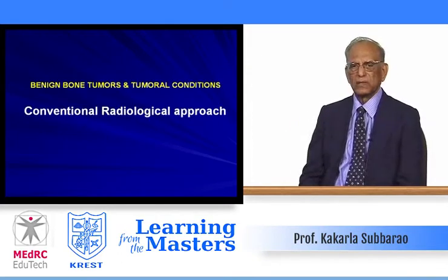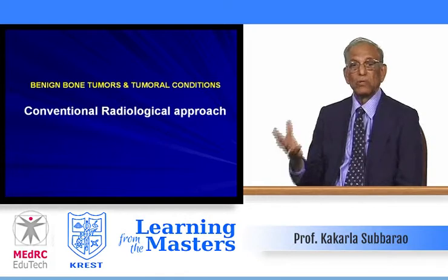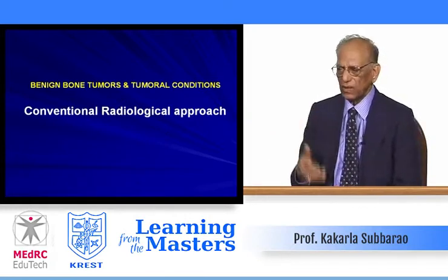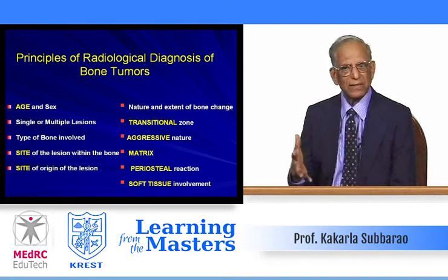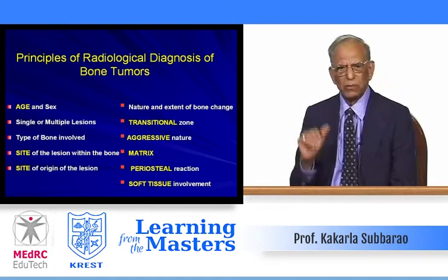Now for this session we cover only benign bone tumors and tumoral conditions, that is, swellings which simulate tumors. And what is the conventional radiographic or radiological approach? There are certain principles. You see, in every madness there must be some methodology. Principles of radiological diagnosis of bone tumors in general, whether benign or malignant or tumoral conditions.